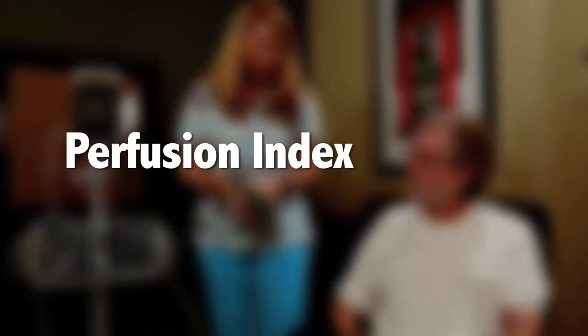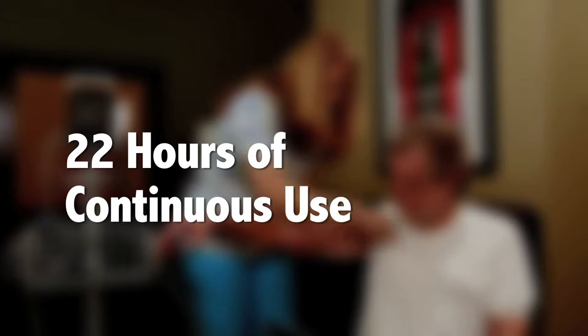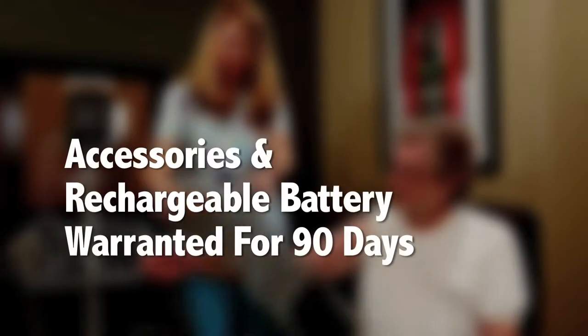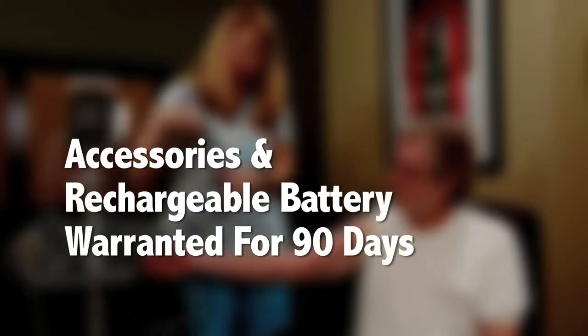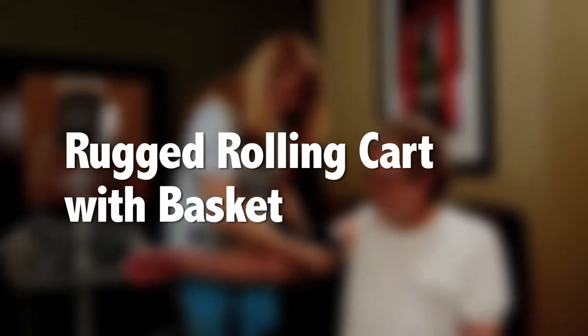PI perfusion index provides indication of SpO2 measurement reliability. A lithium ion battery provides up to 22 hours of continuous use. Up to a 3-year warranty with a replacement loaner program. Accessories and rechargeable battery are warranted for 90 days from date of purchase.